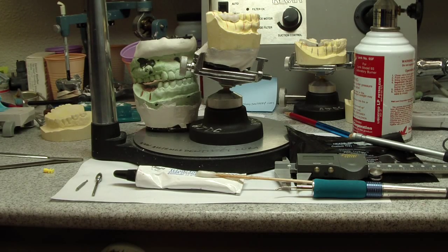Hey folks, Ashley from AllThingsDentistry.com. Today I'm reviewing and fabricating a surgical implant surgical stent.